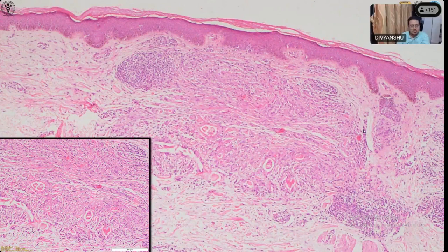See, there is a very big granuloma, right? Very big granuloma. There are many structures in the center. There is no caseous necrosis. There is some gap here, with lymphocytic infiltration. While looking at this, what do you think? There is no necrosis, all histiocytes. There are giant cells.